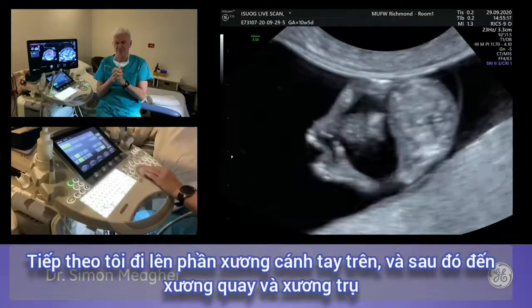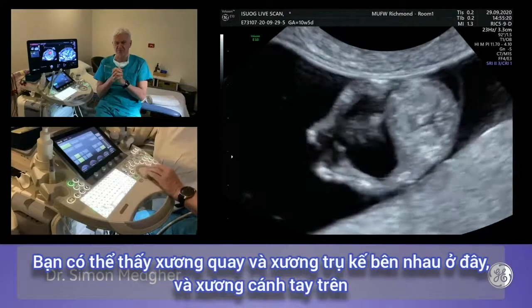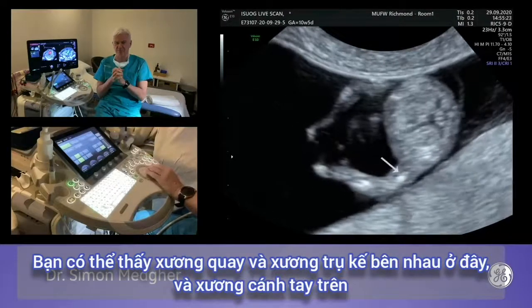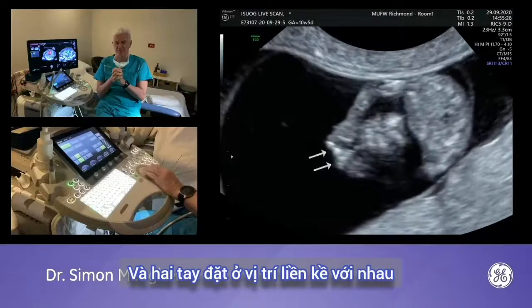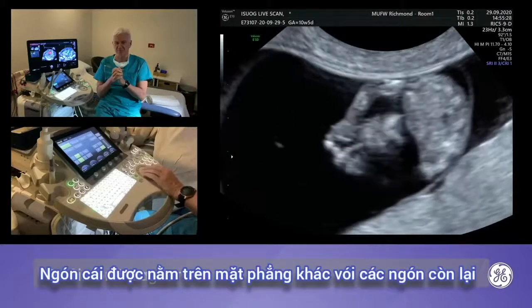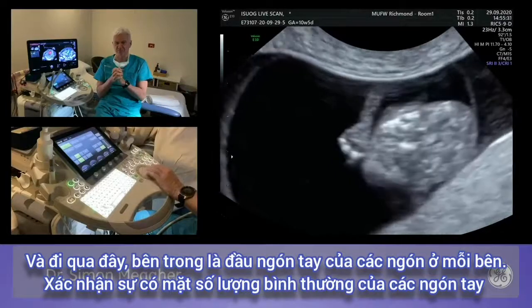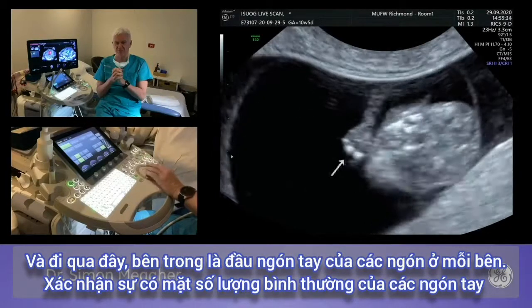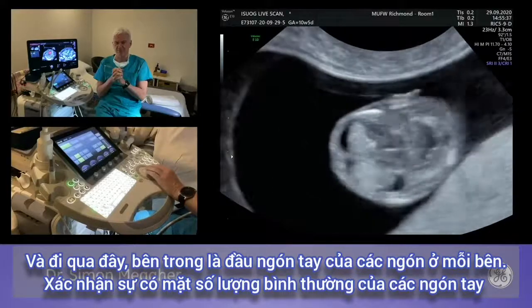Moving up to the humerus, then onto the radius and ulna visible side by side. The hands are held juxtaposed to each other. The thumb is held in a different plane to the digits of the fingers. Coming across, you can see the little tips of the digits on each side, confirming the presence of a normal digit count.